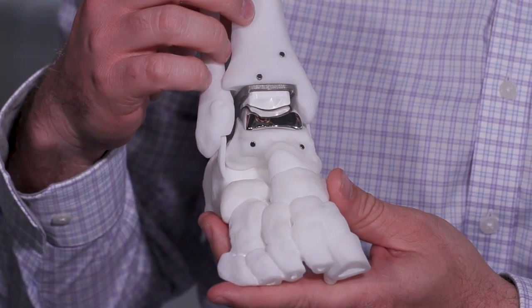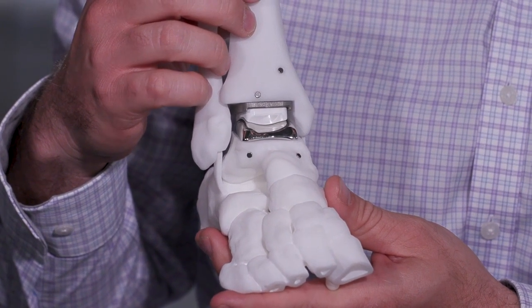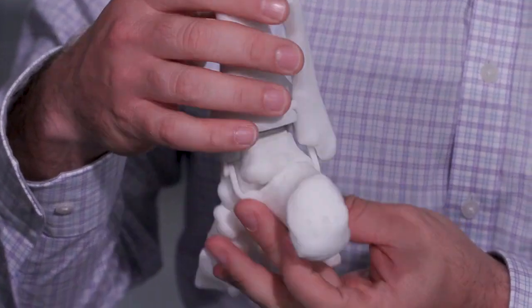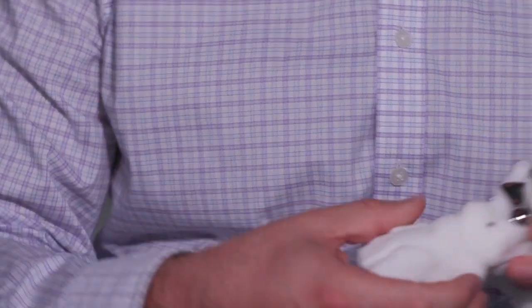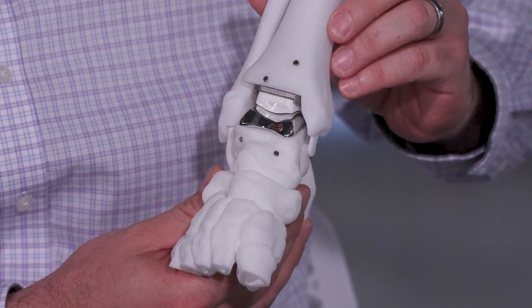So the tibial component — how is this produced? This is a 3D printed titanium implant that we can print here as well, that has a porous structure on the top so you get that bony in-growth on the top tibial feature, as well as the cobalt chrome on the bottom.